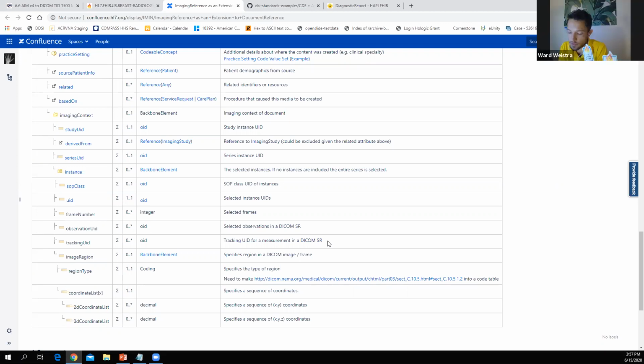Okay, very good. So this will help with tracking specific entities, patients, over time. Again, obviously because the study UID aligns to a session number, which aligns to a particular patient, we would all be able to track them over time.